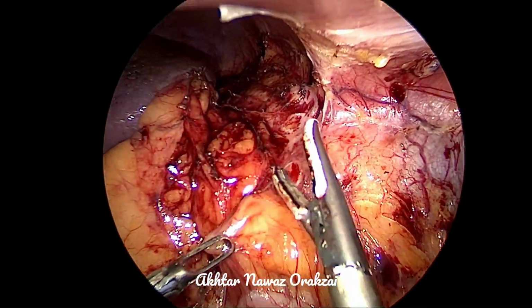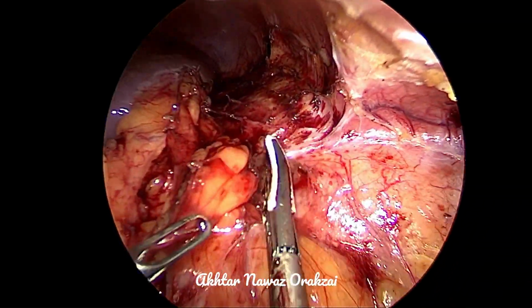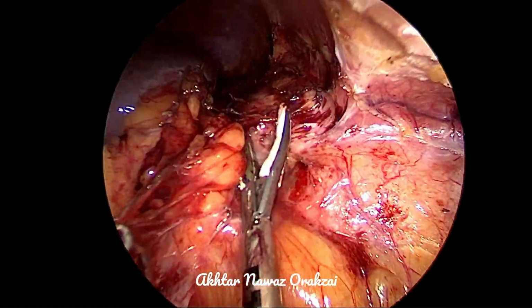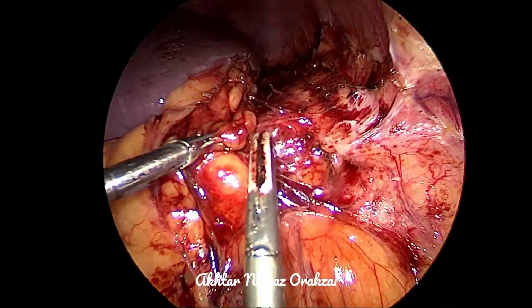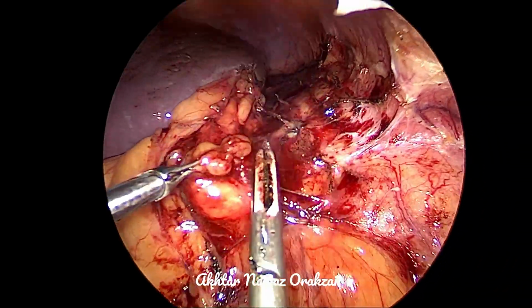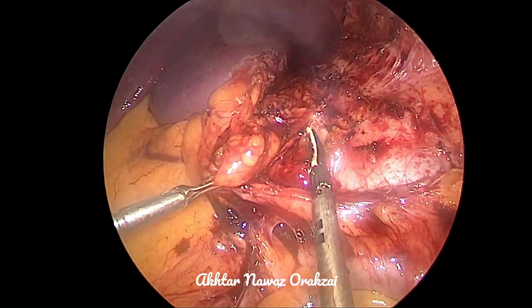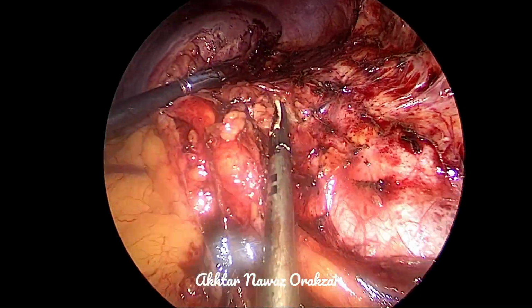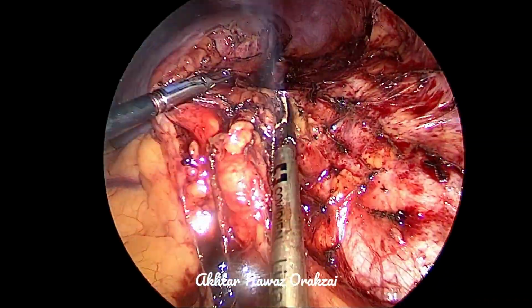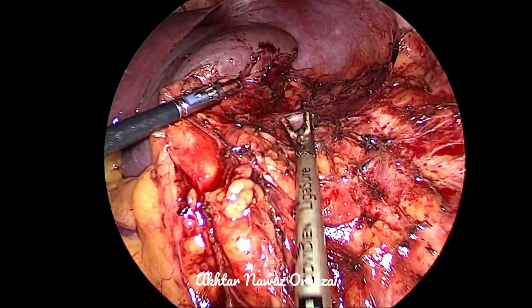You can see that lower down where there is no kidney, the tissues are quite good. The tissue planes are quite discernible, and one can easily dissect the colon away from the kidney. But where there is kidney and there are signs of inflammation, it is really badly stuck, and mobilizing this kidney leads to a little redness of the field, which can hamper the dissection and the vision.